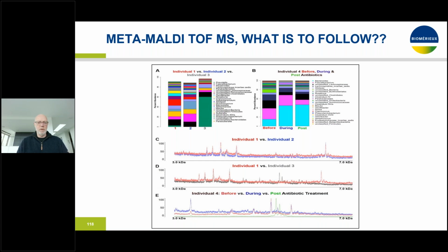But what you can do is, if you take a fecal specimen, you have to clean it up a little bit, but you put it directly on your mass spec slide, you'll get sort of arbitrary peak patterns. And these peak patterns are indicative of floral complexity. So the more different organisms you have in your fecal specimen, the more complex the pattern will be.